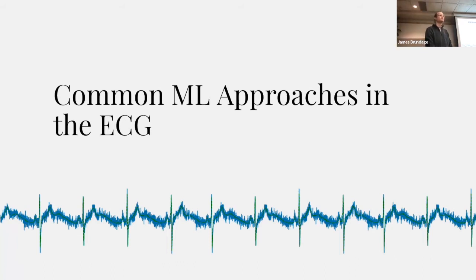Obviously, all of these ECGs, are they saved in a computer, like some digital, computer readable format? So that was one of our first questions, because if you look in the hospital's medical record system, they're saved as essentially images, but not the raw data. And so we actually had to dig back into the company that actually builds the machines that do the recordings, and they store a database of the raw signals themselves in a legacy database system that has not been updated in a very long time, because they never anticipated that people would need to get the raw signals out. And so that actually became a huge part of our project, extracting the raw data from the Muse system and then making it so that we could match it to our EMR data.